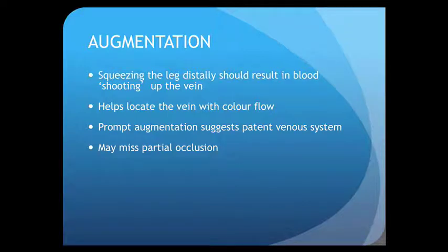Now that can be useful in a couple of situations. First is, if you're struggling to find where the vein is, and you do this, you may then be able to detect where the vein is.